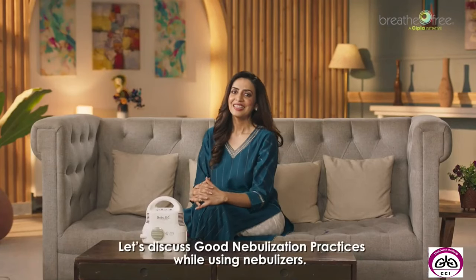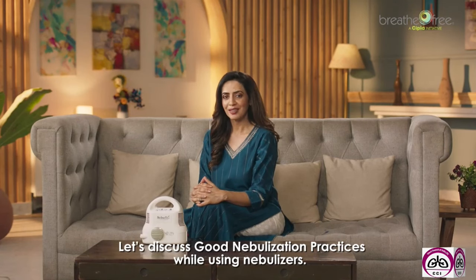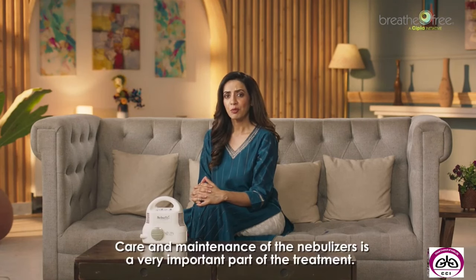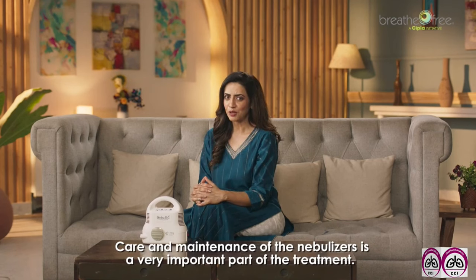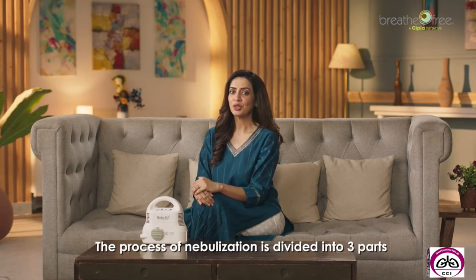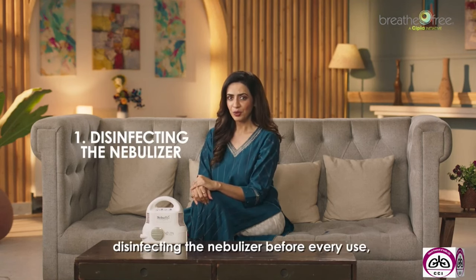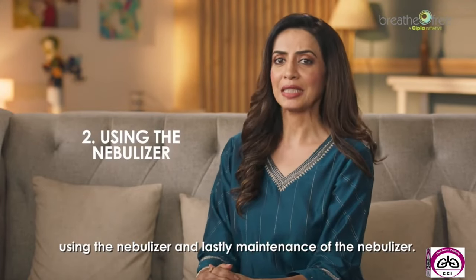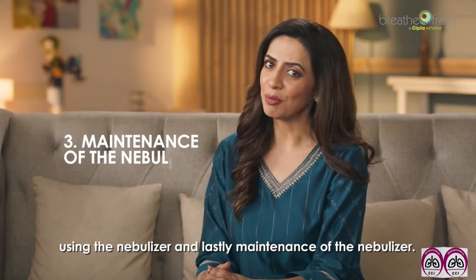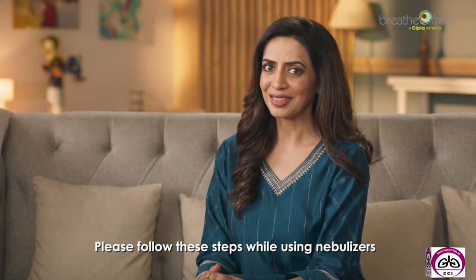Hi there. Let's discuss good nebulization practices while using nebulizers. Care and maintenance of the nebulizer is a very important part of the treatment. The process of nebulization is divided into three parts: disinfecting the nebulizer before every use, using the nebulizer, and lastly, maintenance of the nebulizer. Please follow these steps while using nebulizers.